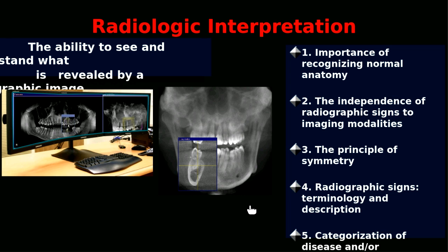Nowadays, I get a lot of requests for doing CBCT CE, for implants, for pathology, for extraction, and so many purposes. The first thing I teach them is you have to understand what is normal and what is abnormal, and you have to differentiate between these two very nicely on your 3D imaging. The second is the radiographic signs and symptoms of those things.